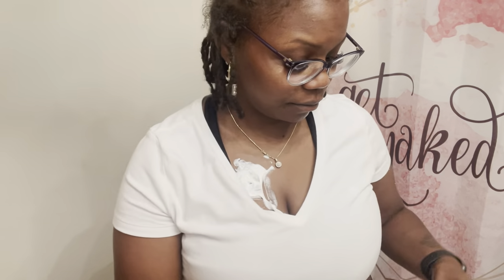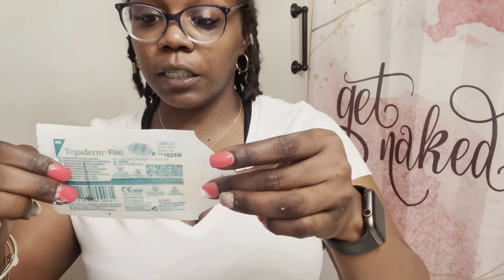So what you actually want to do is you want to put globs all over where you feel the port - just glob it up there. Make sure you cover your whole port area.